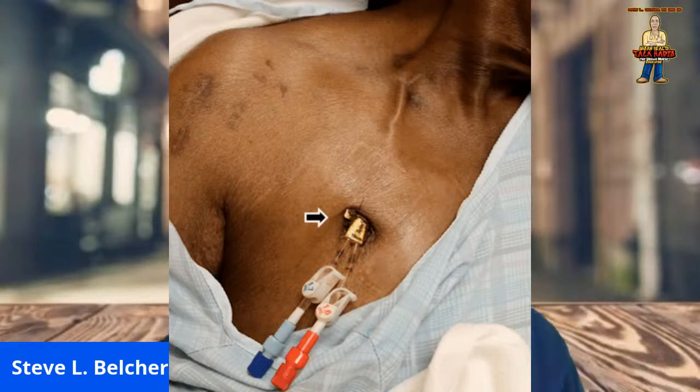Clots can form inside the opening of the catheter or form on the outside of the catheter and block the opening. This can cause blood to flow at a slower rate than the rate your doctor ordered. If the blood flow rate remains low for more than one dialysis treatment, the catheter should be checked and treated the same day. It is important to restore the recommended blood flow rate and treat clots that are forming so that your catheter continues to work well and you get the amount of dialysis you need.